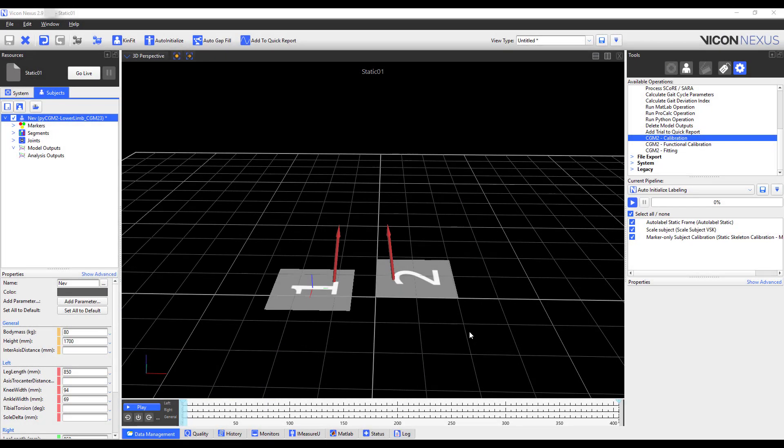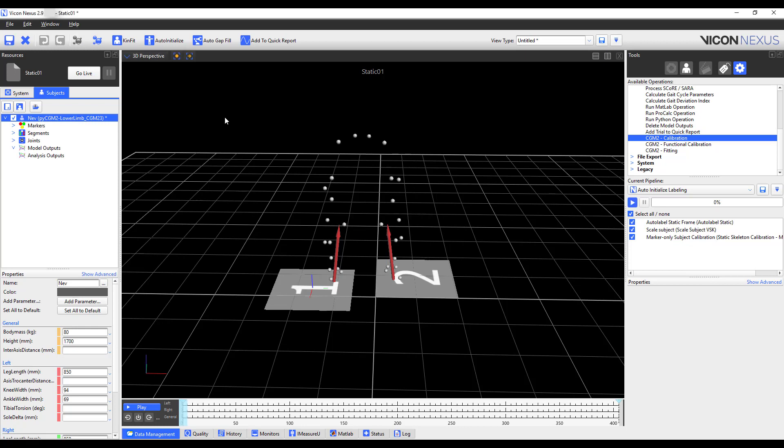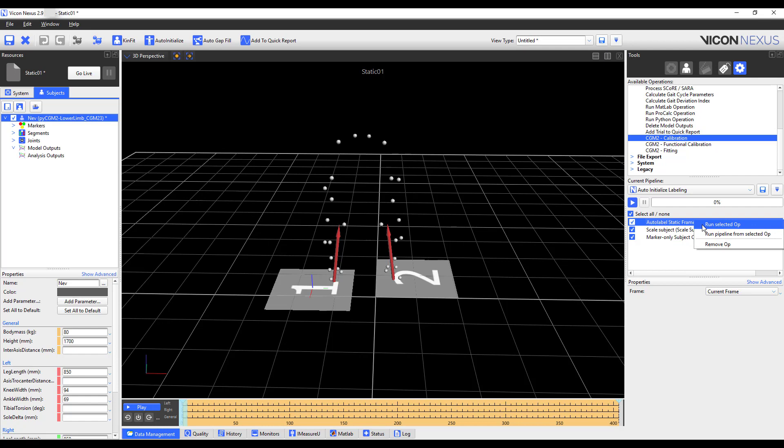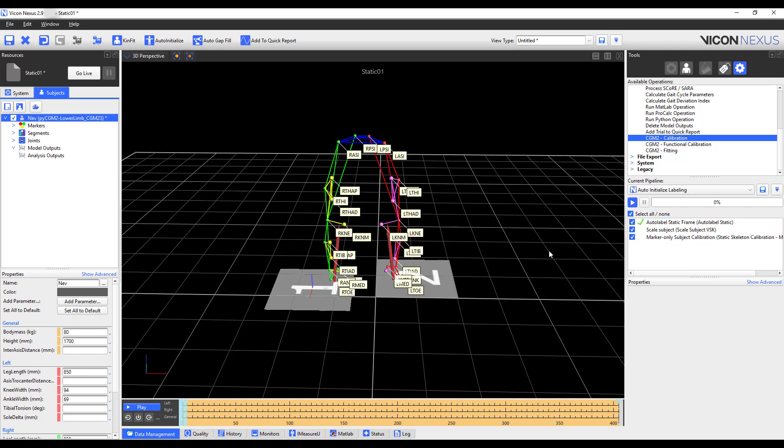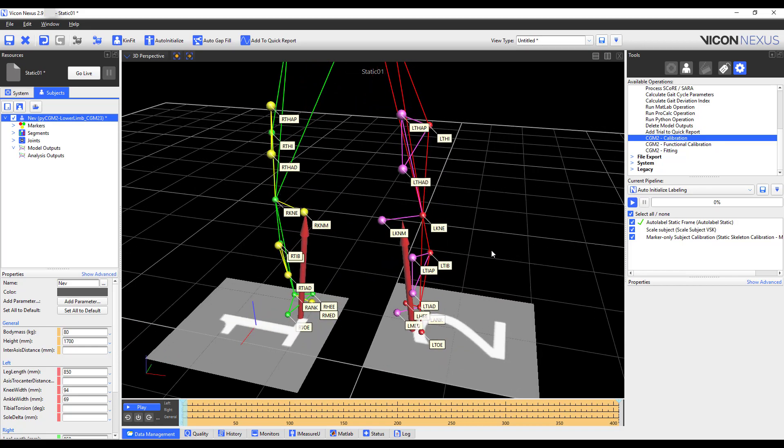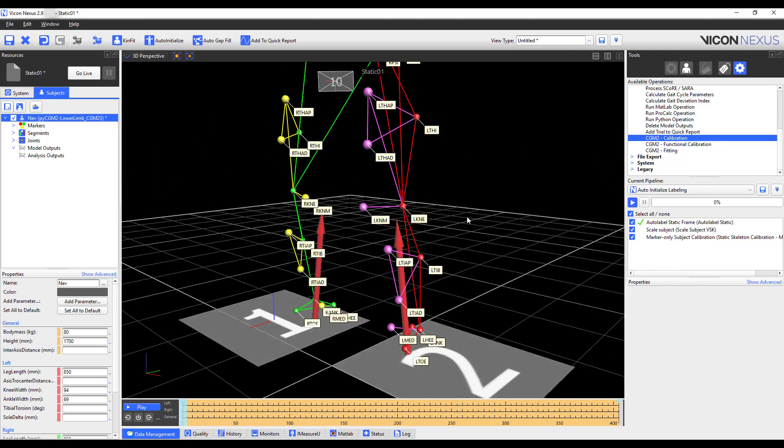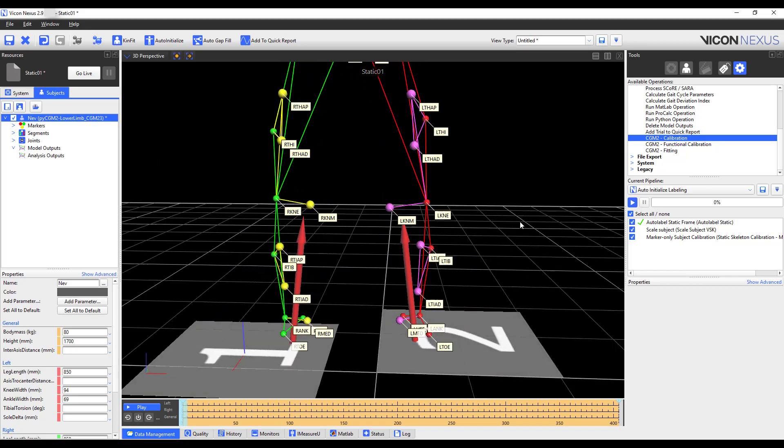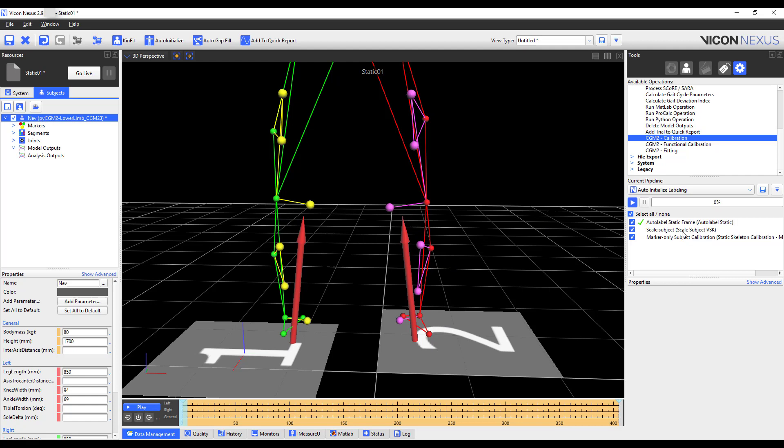Now let's walk through an example. Here I'm going to process trials from the skin clusters model, which is the third model listed on the CGM2 GitHub page. I'll check that I have the correct VST chosen here, which should be pyCGM2-lower limb_cgm23, and that I have entered in all of the required anthropometric measurements. I will reconstruct, and then I will run the autolabel static from the pipeline. I will check my labels really quickly before running the last two operations within this pipeline.